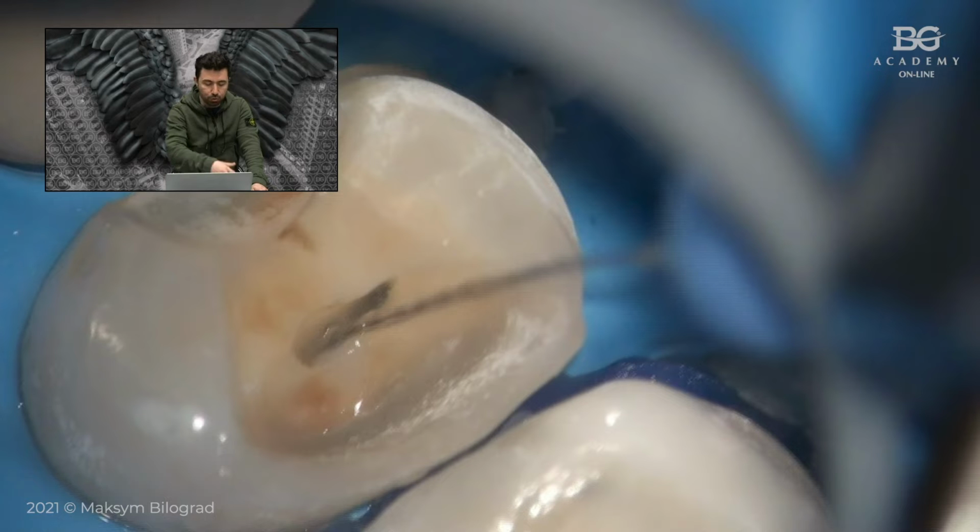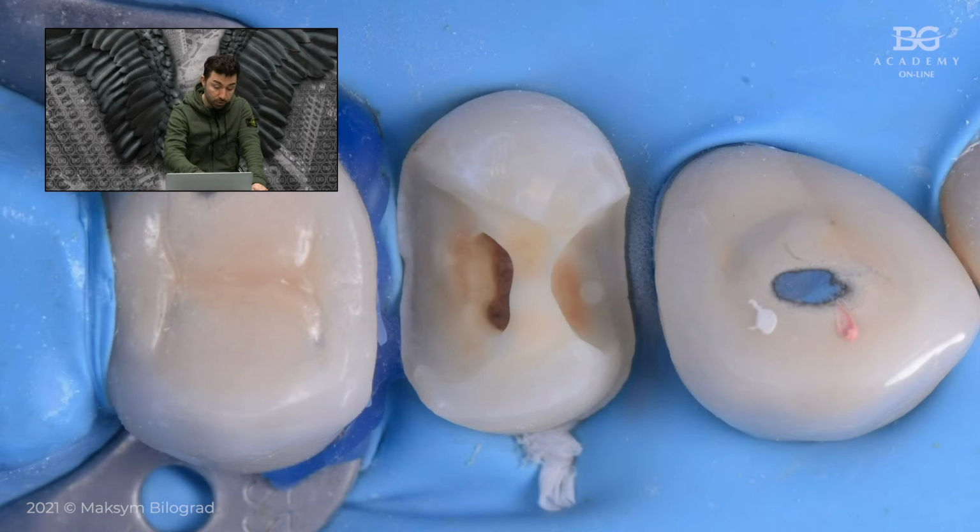The irrigant will be able to dissolve pulp. We used sodium hypochlorite, and at the same time we were able to finish our preparation. So you can see now it is almost done. The only thing that is missing is build-up or IDS, immediate dentin sealing, covering the undercuts, and that's it.